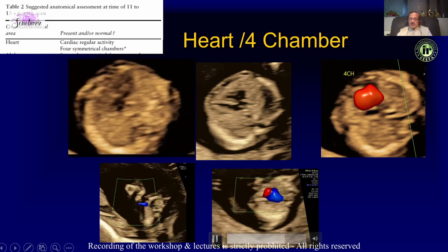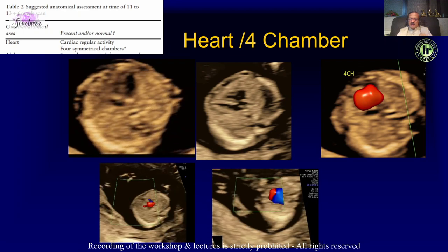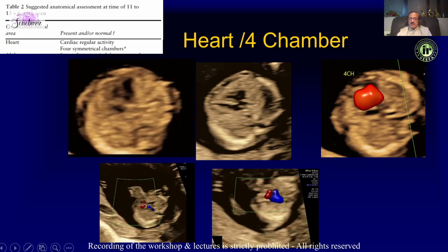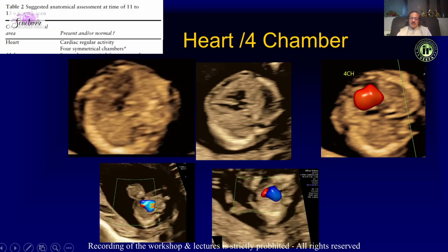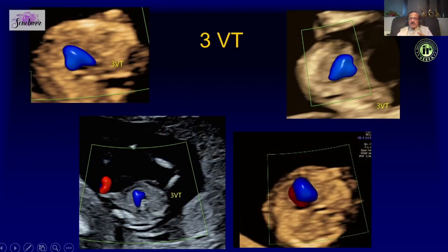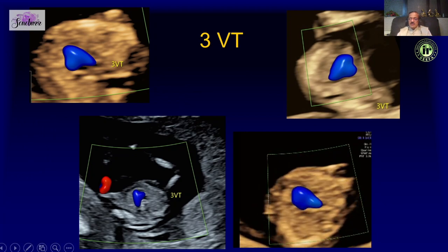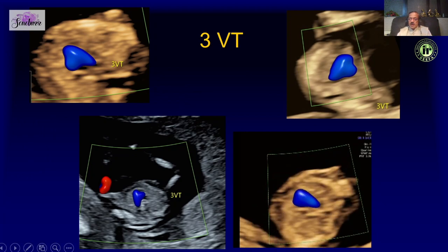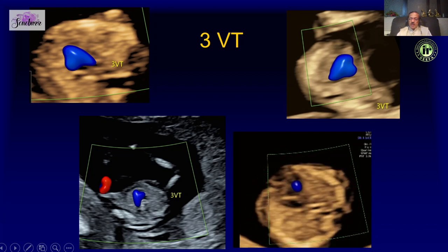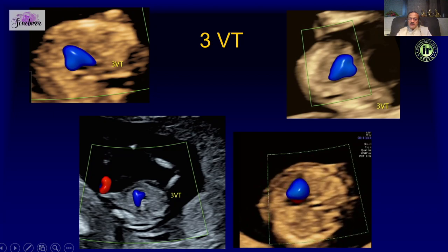We can see the flow across the tricuspid and mitral valves, and then go up just as in the second trimester to take a three-vessel view with the help of color Doppler or power Doppler. This is often referred to as a tick sign in the first trimester.